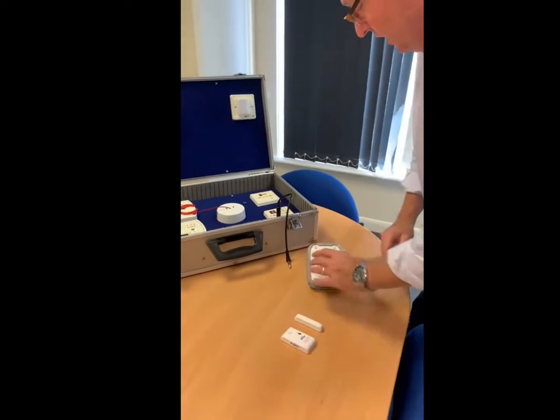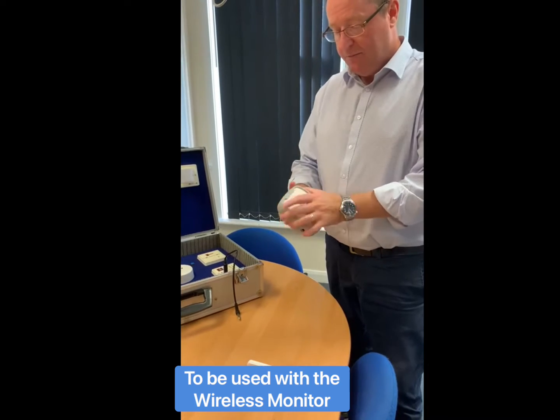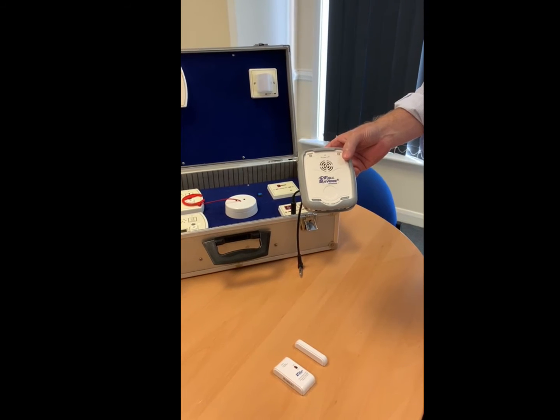So this is the wireless device. We're going to power it up to start with. It's going to get lots of flashing lights, and that will settle down. And once that's settled down, we can then pair it.